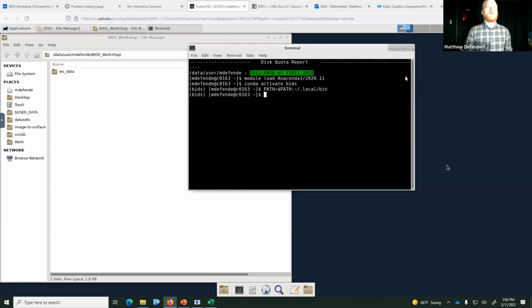So what I would say is that it might be possible, but what you need to do, and we'll talk about this when we write out the full command later. One, you would say in /d, you would point to all of the relevant NIFTI files. Two, you would not give dcm2niix as a converter. You would just say none as a conversion tool because you're not converting from DICOMs to NIFTIs.